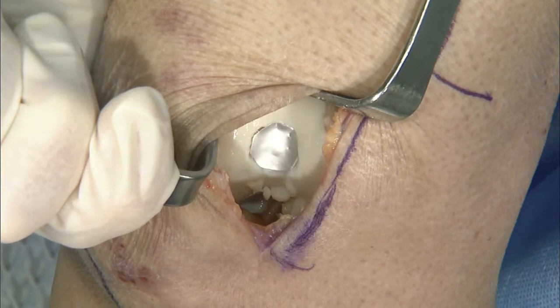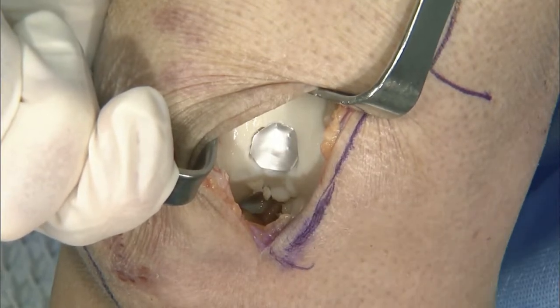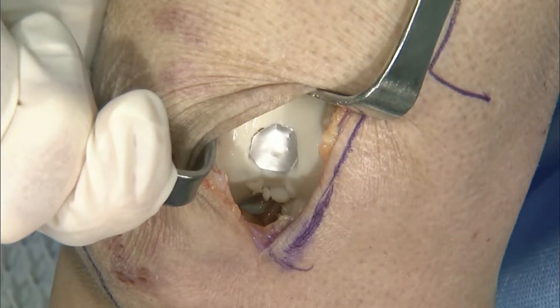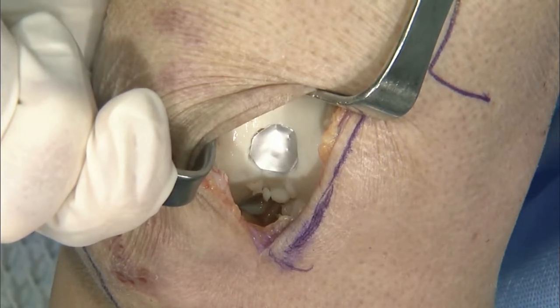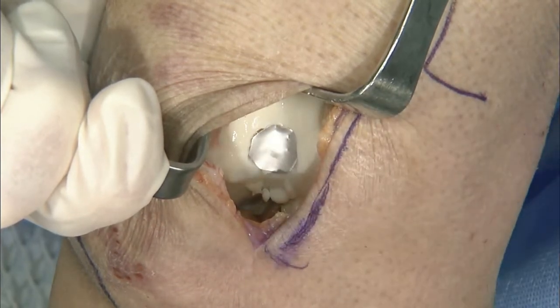No, but I would say that even this, in terms of the size here, with cutting out the MACI implant, I will leave my template a little bit bigger because I sometimes find that it's easier to cut into my template as I'm cutting out the MACI implant because it keeps it in place a little bit more. But this is the defect prep, basically, and then this is creating our template for this.